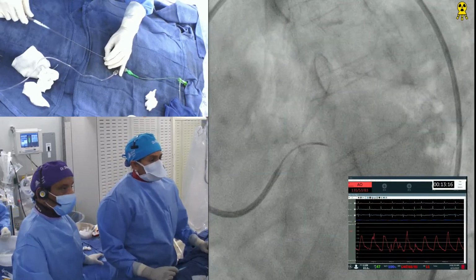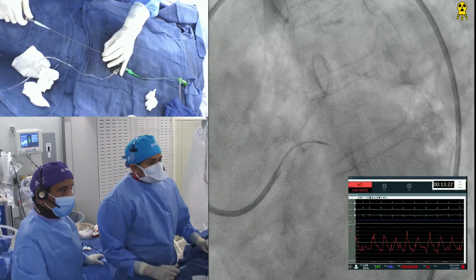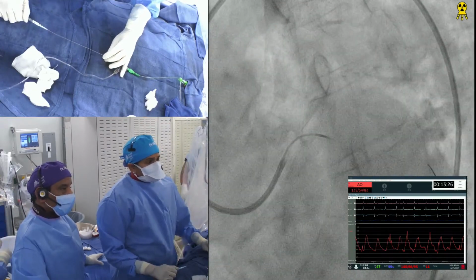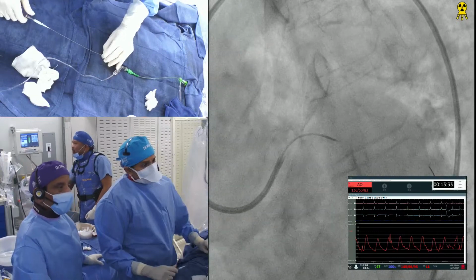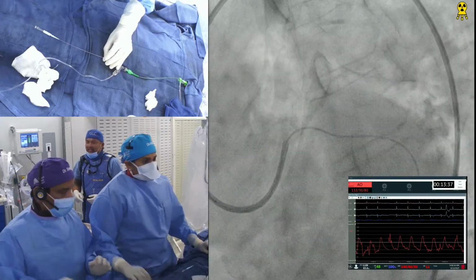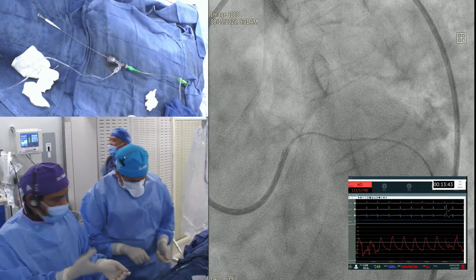All right. That's number one, and the other one I wanted to do side by side, because we have a little channel there. But remember, wire alone, side by side, will not go because that angle still exists. The balloon try is okay, but I don't think the wire side by side is going to work, because you still need the same catheter. Good. Very good. Don't insult. I didn't insult. I said it will go.